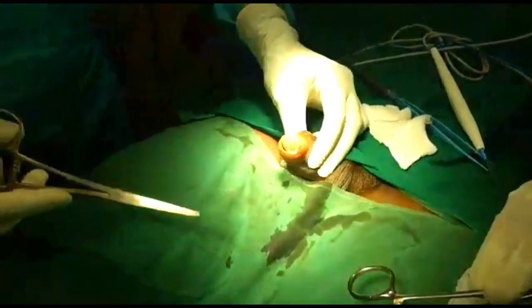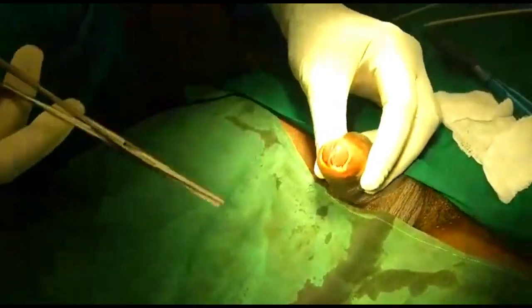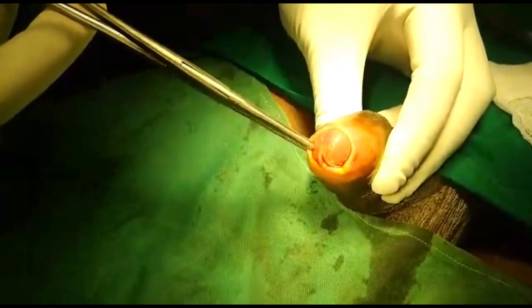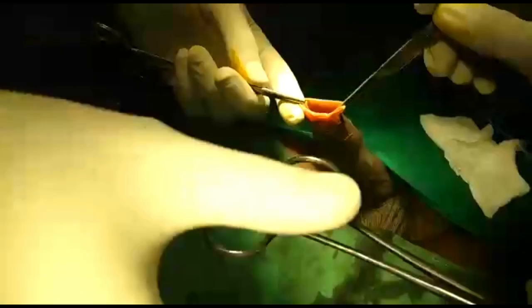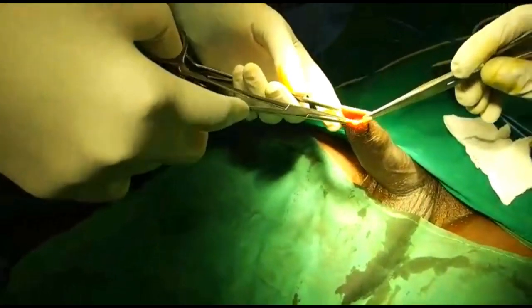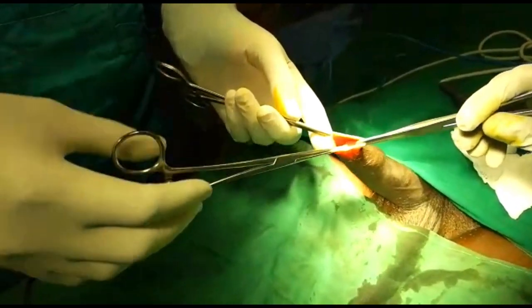Now we are going to show you the penis. As you can see this is a tight foreskin. Circumcision stapler is basically done for patients who have tight foreskin — that is phimosis. You can also see that the frenular area here is quite short.